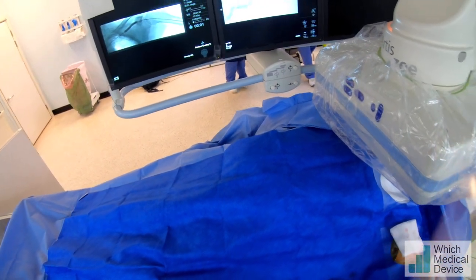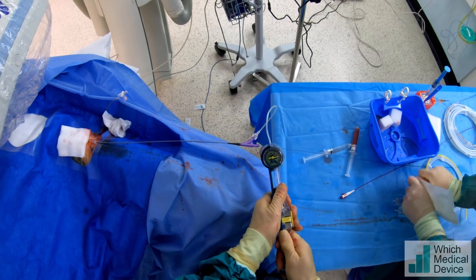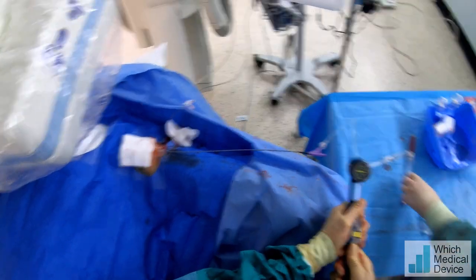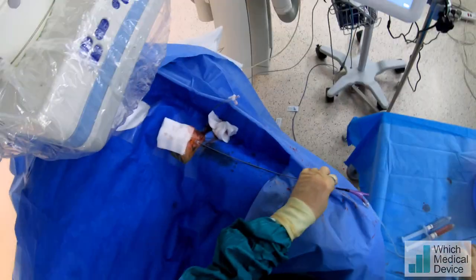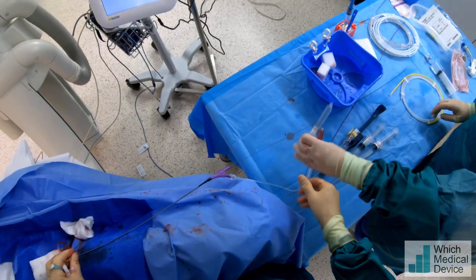That waisting has almost gone. Okay, we're just going to deflate that now and we'll have a little look. We'll probably just do a run through the sheath.